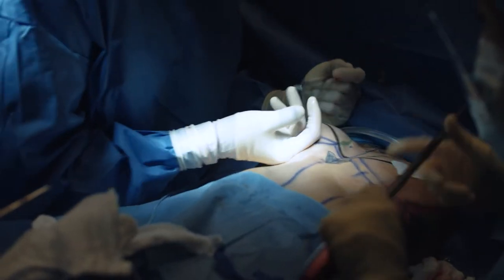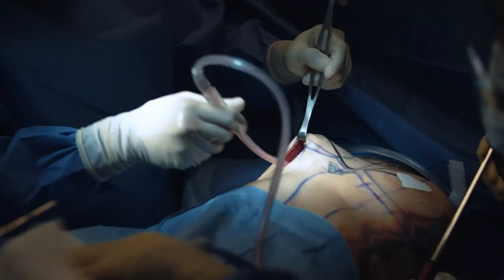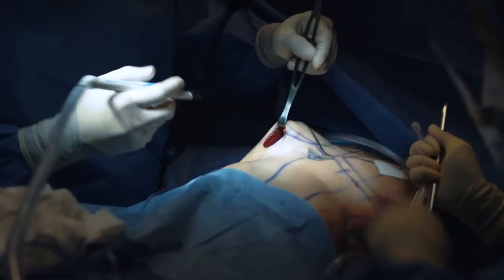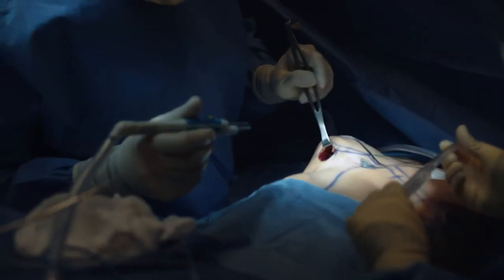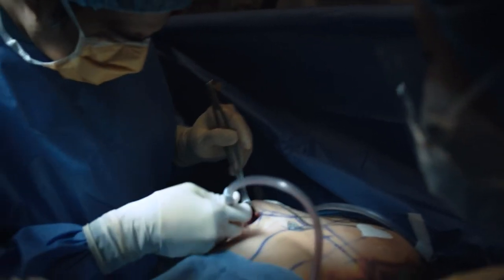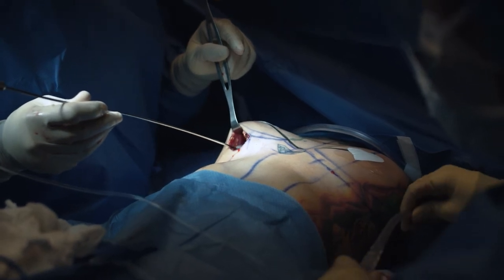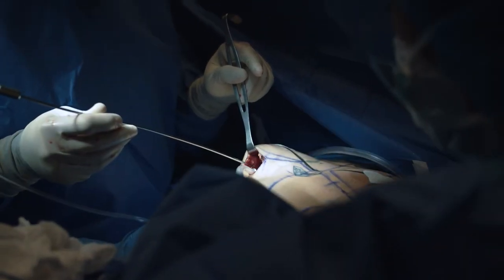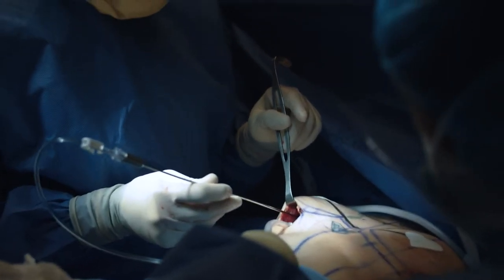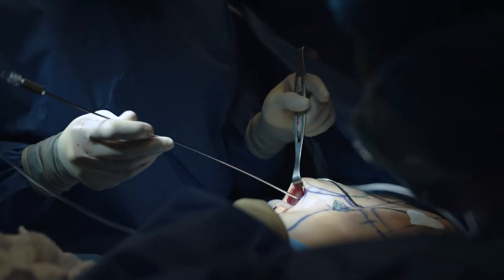Okay, like that. Get up a little bit more. Okay. Suction. I'm going to free up a little bit more of the muscle so I get a nice drop in the middle and get maximal cleavage. Now we're irrigating, making sure there's no bleeding. Suction. And you can see the fluid coming out clear, which means there's no bleeding, right, Janelle?